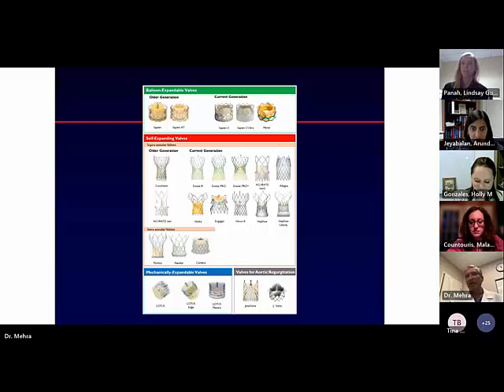There are 2 types of valves which we consider. The one is the balloon-expandable valve, which is mostly the SAPIEN valve, and the series of that now is the SAPIEN 3 or SAPIEN Ultra. And there is one valve which is available outside of the US, called a MyVal.